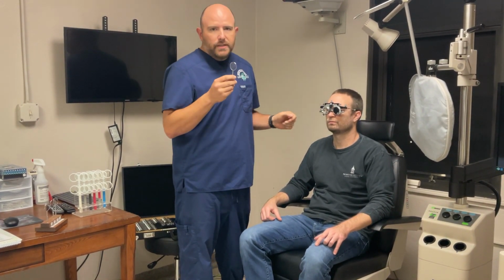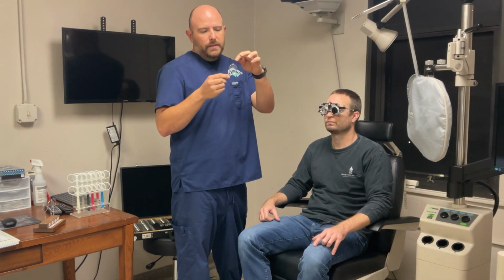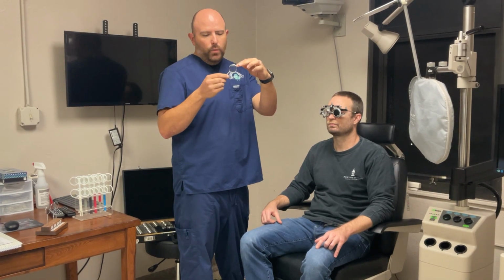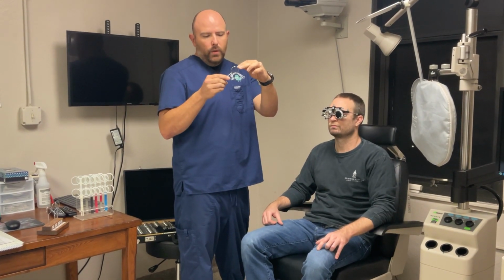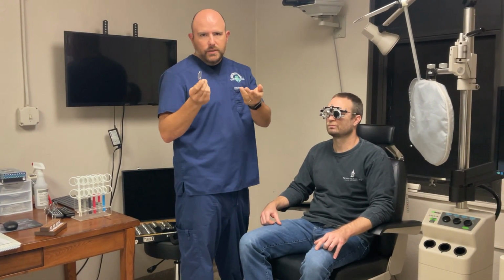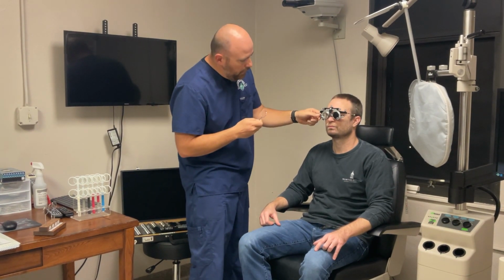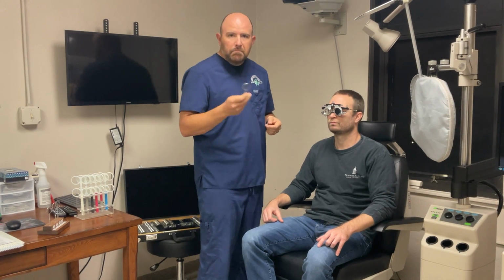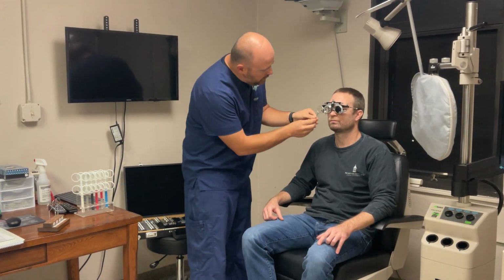So all I'm doing is chasing the red. For instance, I'm putting the cylinder axis here, and if I say this is 1 and this is 2, he selected 1, so then I'm going to turn the cylinder axis just like you do with the JCC lens in the phoropter. And I'm moving it about 15 degrees each time that I'm changing the axis.